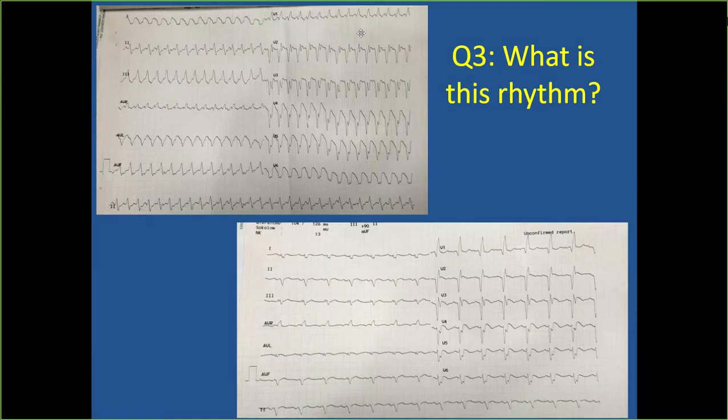Have they voted already? Yes, sir, the maximum is VT. Correct. And second followed by LVOT. Okay. At least there are some who think otherwise.